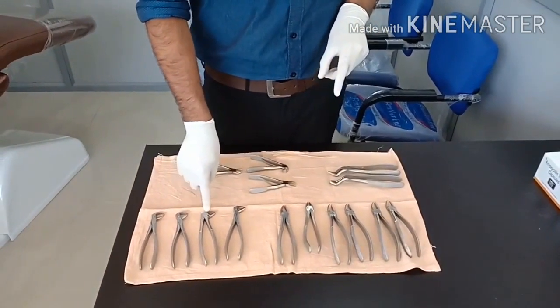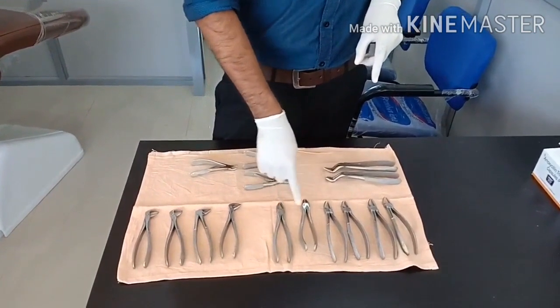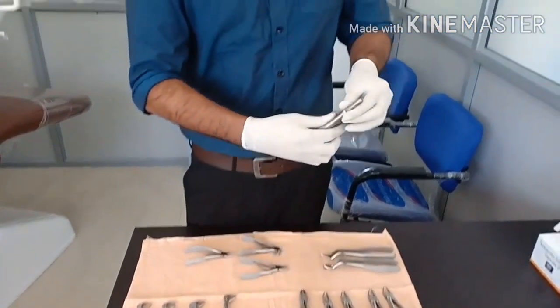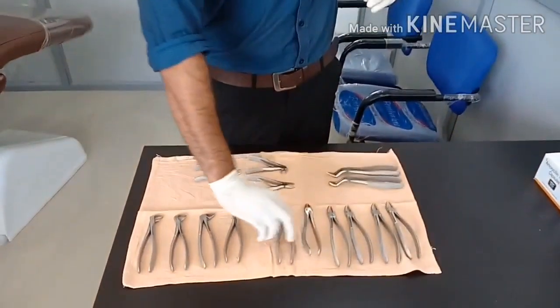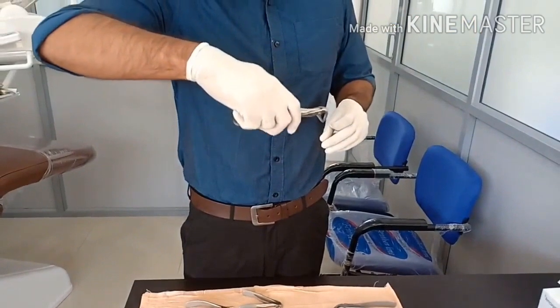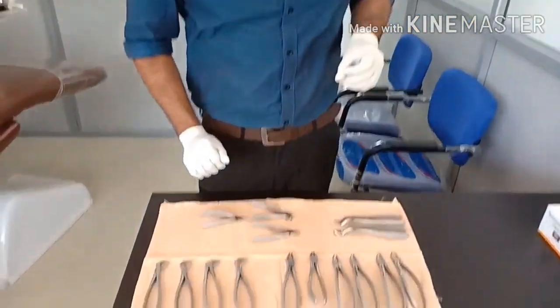On the upper jaw forceps the hinge and beaks are on a straight line with not much angulation, and on the lower jaw forceps they are at 90 degrees. This is for ease of access — so you can easily perform upper tooth extraction and lower tooth extraction comfortably.